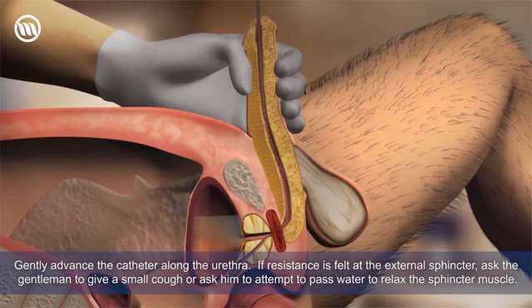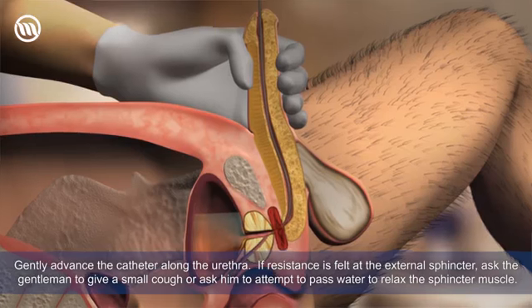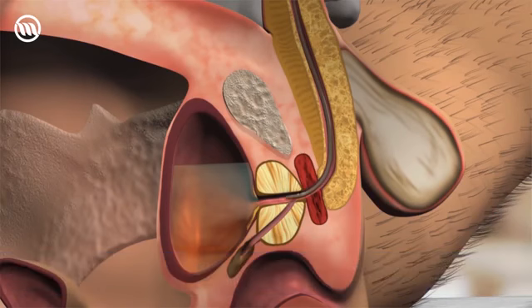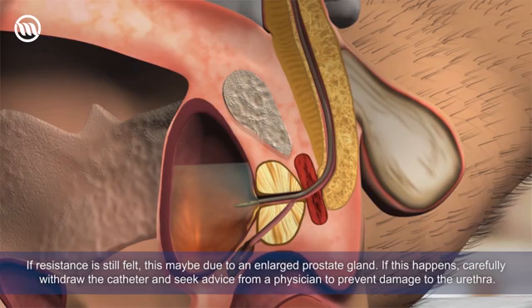If resistance is felt at the external sphincter, ask the gentleman to give a small cough or ask him to attempt to pass water to relax the sphincter muscle. If resistance is still felt, this may be due to an enlarged prostate gland. If this happens, carefully withdraw the catheter and seek advice from a physician to prevent damage to the urethra.